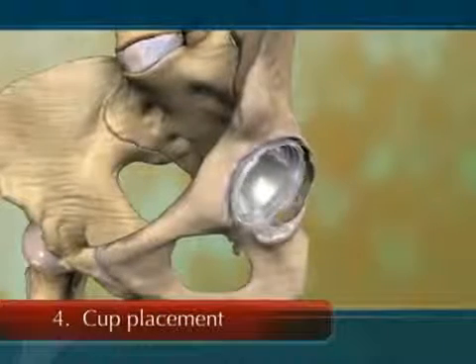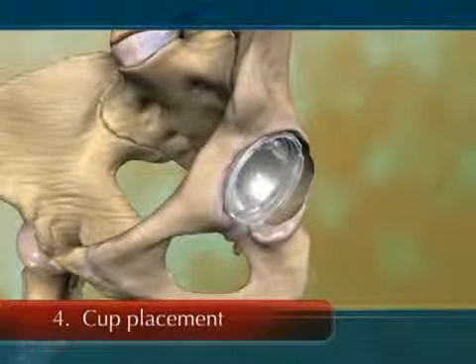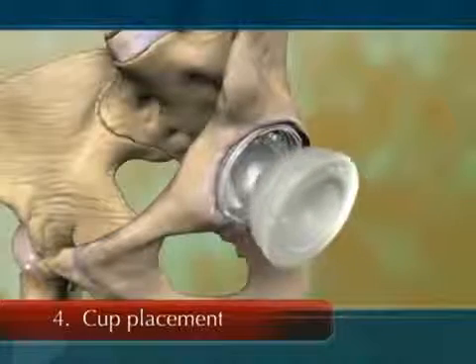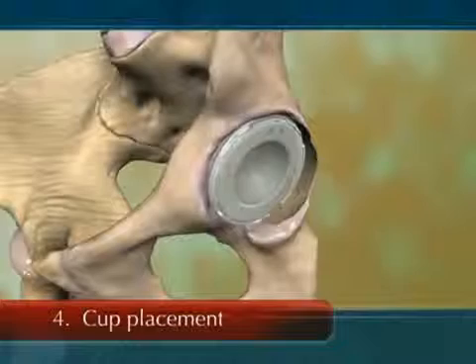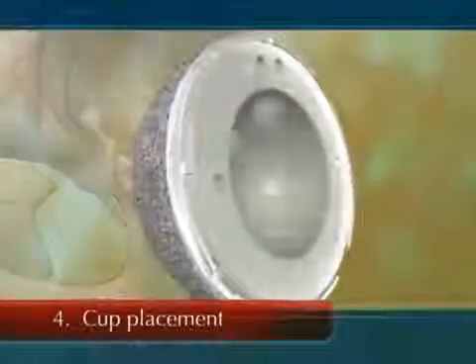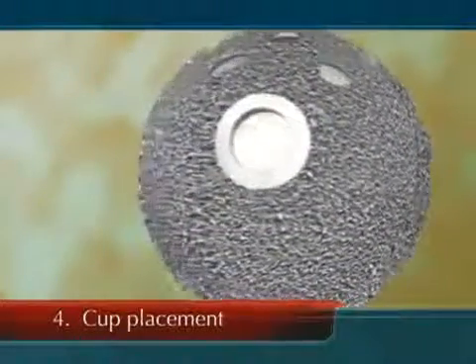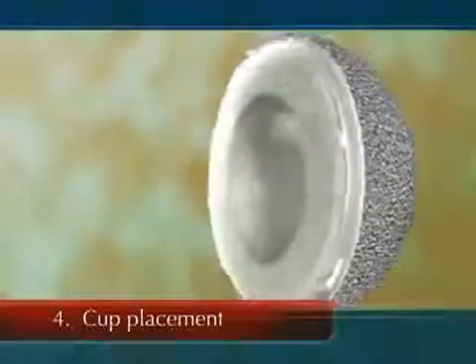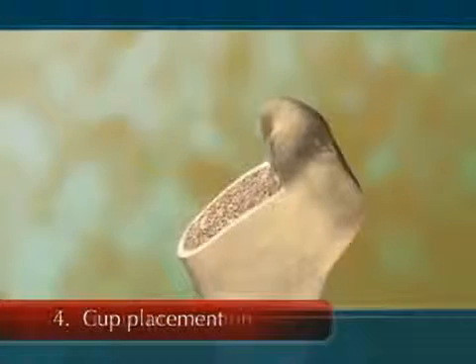This cup is held in place using a number of methods depending upon surgeon preference and your bone quality. These methods may include bone cement to hold the cup in place. Most cups are designed to allow bone to grow into the metal surface to hold the cup in place. These cups have a roughened or specially prepared surface, which is designed to allow ingrowth of bone into the metal itself. This type of fixation may be augmented by screws to help fix the cup in place while bone growth takes place.